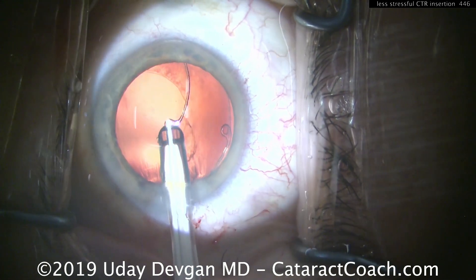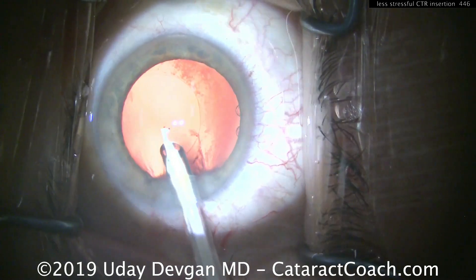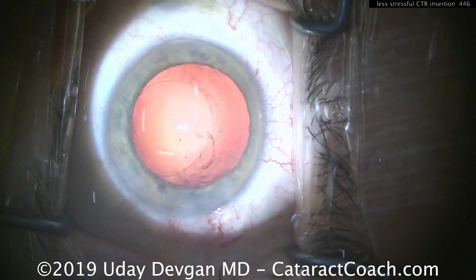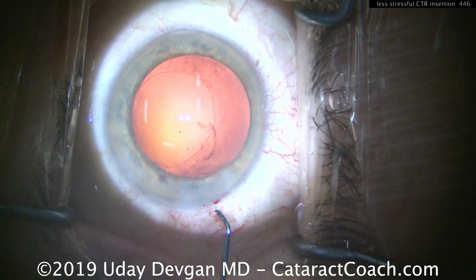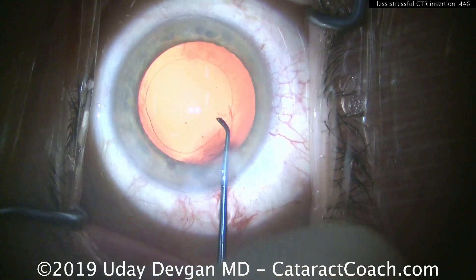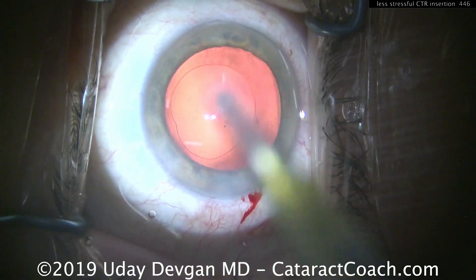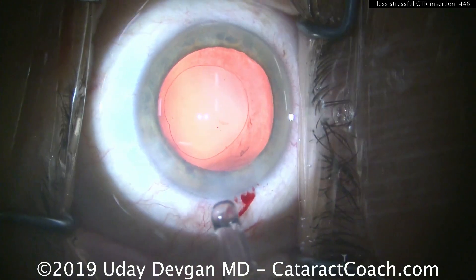We have to make sure the tip of the CTR goes around the capsular bag equator like this, and we have to make sure it doesn't poke through any part of the capsular bag equator. Sometimes that's not easy to do. This video, which was anonymously submitted, is very helpful — it's a technique I've seen before and think is a great idea.